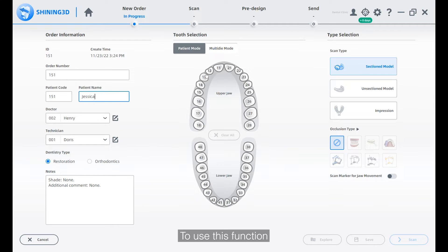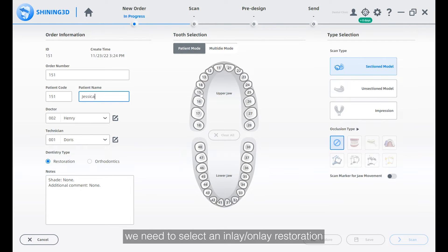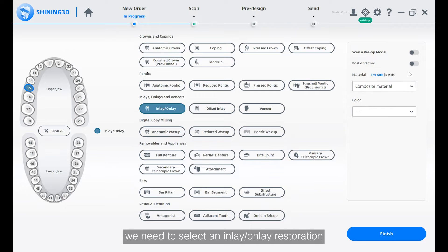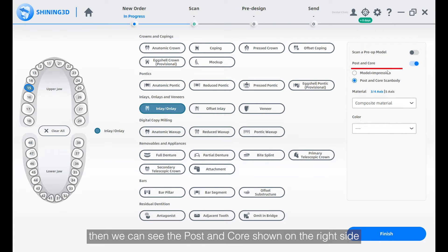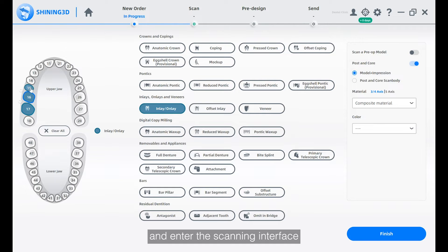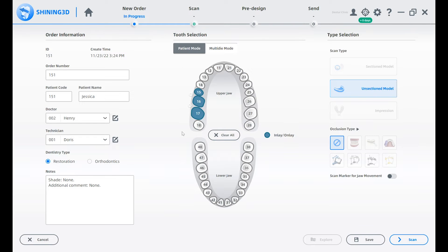To use this function, when we create the order, we need to select an inlay-onlay restoration. Then we can see the post and core shown on the right side. Then we will select the Model Plus Impression button and enter the scanning interface.